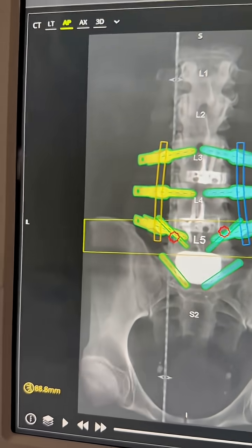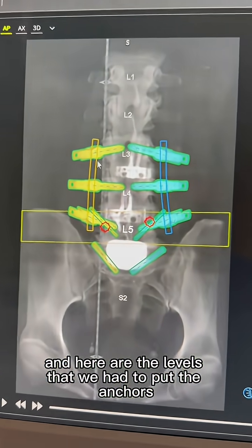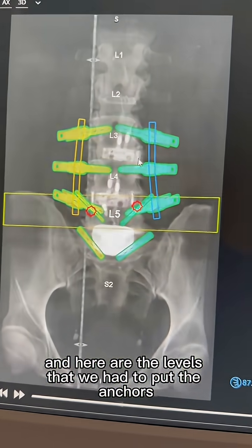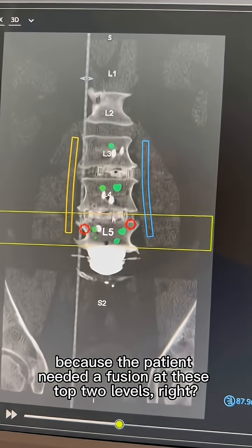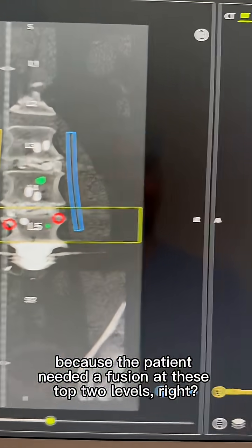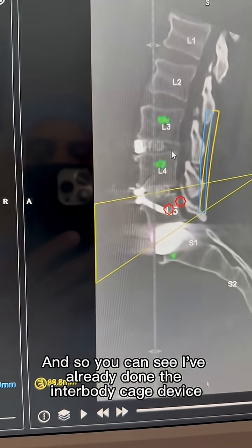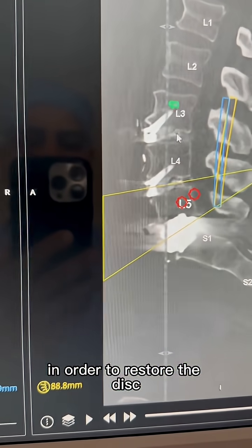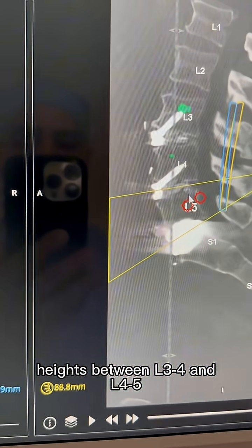What you're seeing here is the planning software for the robotic technology. Here are the levels where we had to put the anchors because the patient needed a fusion at these top two levels. You can see I've already done the interbody cage device in order to restore the disc heights between L3-4 and L4-5.